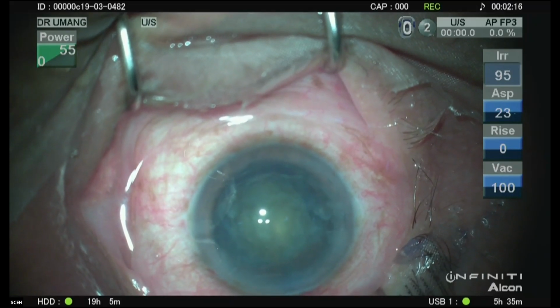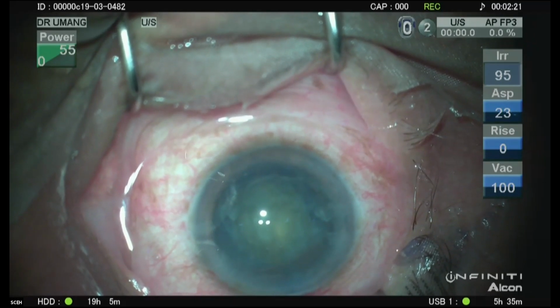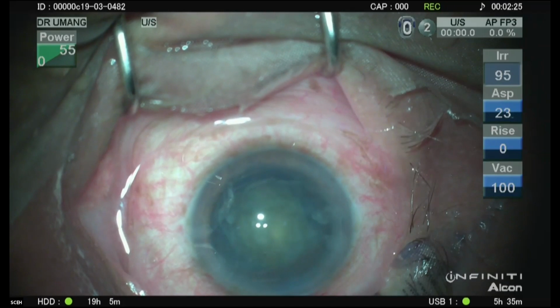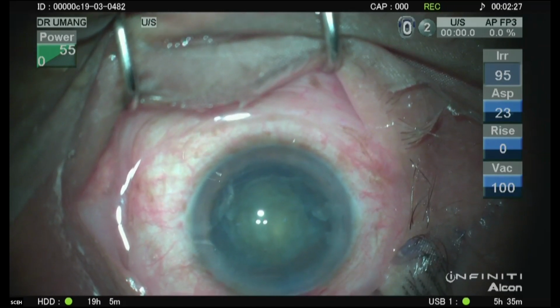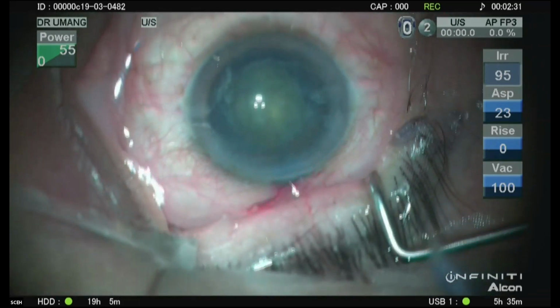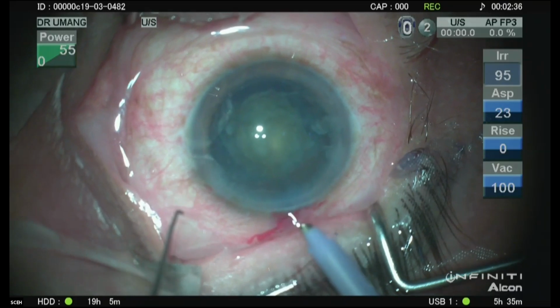It's not something that has to be done only now. By creating a little space after trenching a little, if you find that your nucleus is not rotating well, you can always go back, and at that point you will be able to do the hydrodissection well.